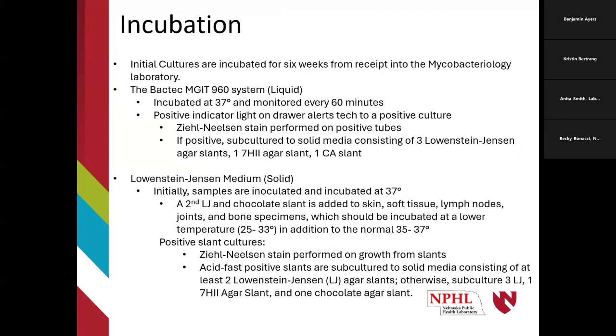So, incubation time. Initial cultures are typically incubated for up to 6 weeks. We used to do 8 weeks, but we did some validations, and I think the APHL or the CDC now recommends 6 weeks. So we're going to incubate it with the MGIT tubes. The MGIT tubes are incubated at 35 to 37 degrees, and the instrument monitors them every 60 minutes.